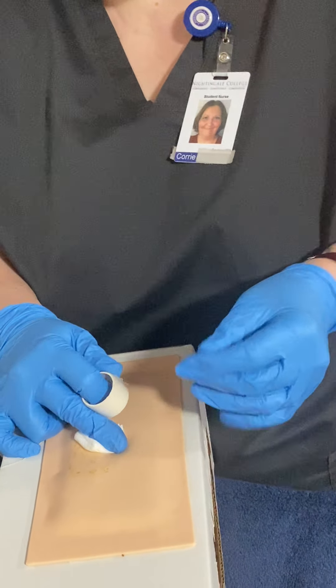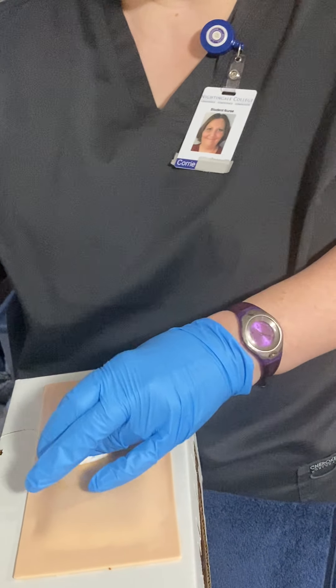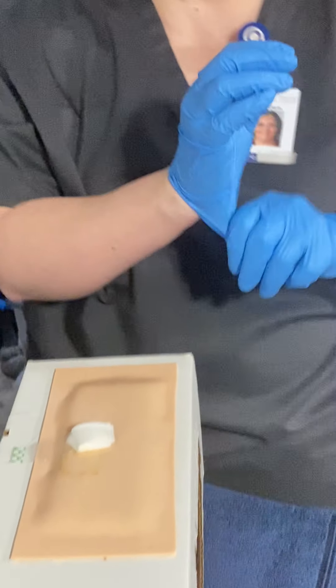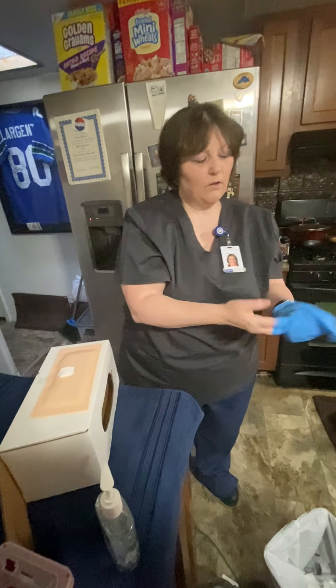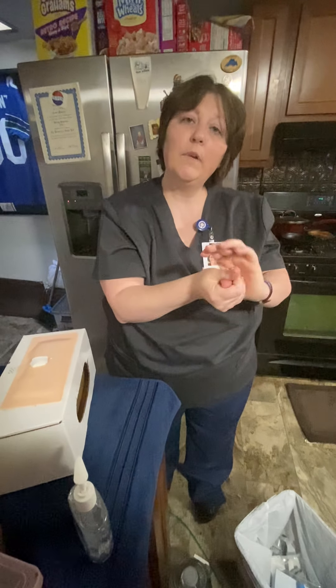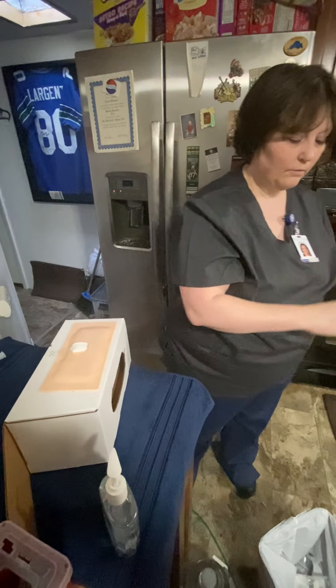When you get home I need you to make sure that you leave this on for about 20 minutes, and then if it's done bleeding you can take it off. How does that feel? Wonderful, thank you. I'm going to clean up my area, take my gloves off, and do hand hygiene. Your call light is to your right. It shouldn't be too much longer before we have those discharge papers ready to go. You let me know if you need anything.